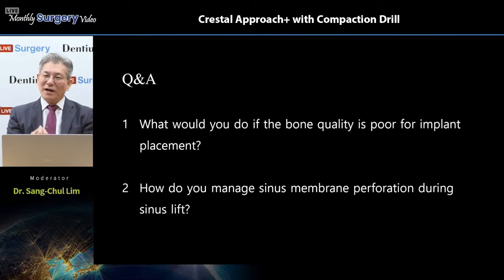However, our hand finds it very difficult to perform this kind of idea. So when you have a big perforation in the crestal approach, flipping to the lateral approach is a good idea. That is a correct procedure.